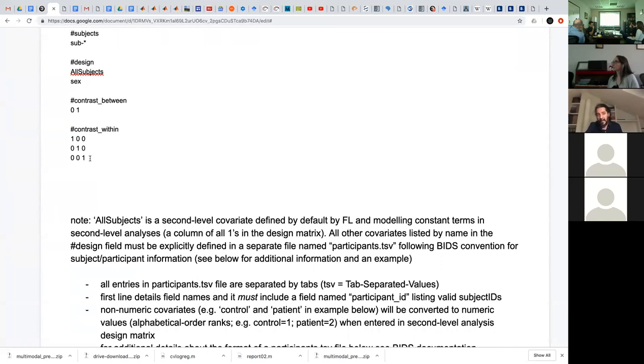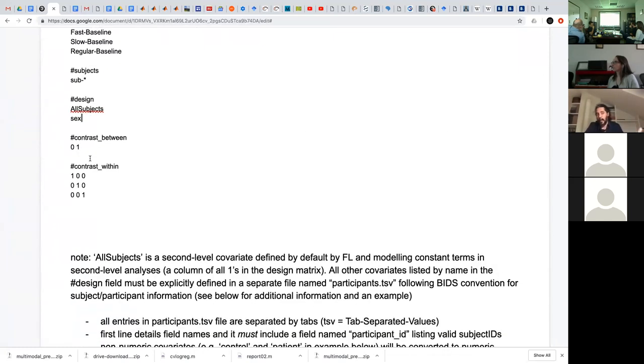So it cannot make sense in that way of specifying contrast. Individual categorical variables that only have 2 levels, so basically 2 groups, work exactly the same way, at least in the practical sense of how you specify the design matrix and the contrast, as continuous covariates. You can treat them typically in the same way.